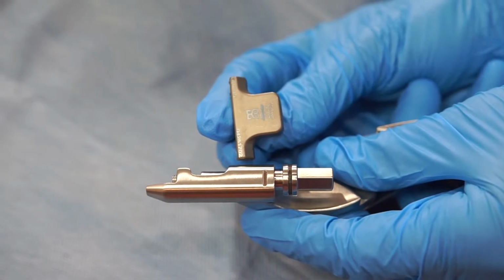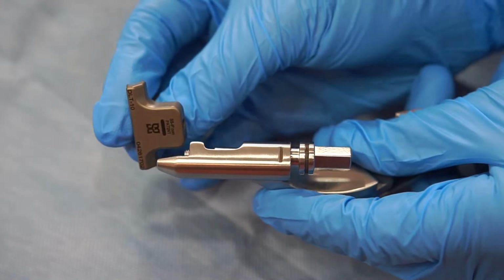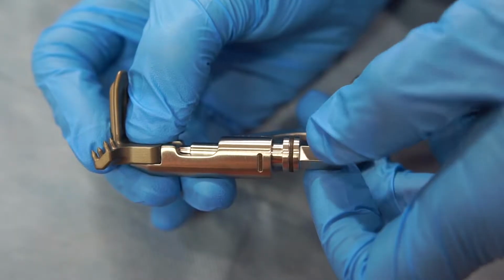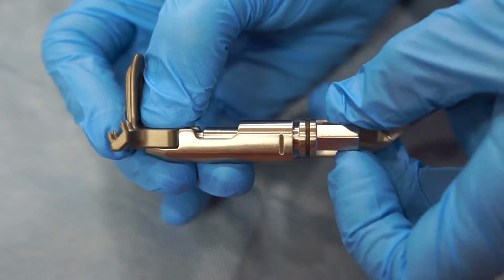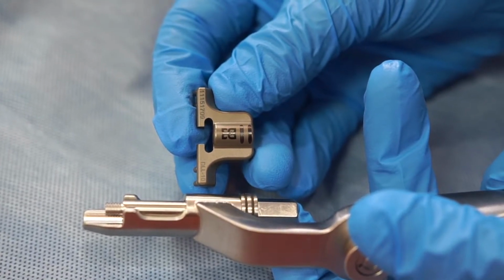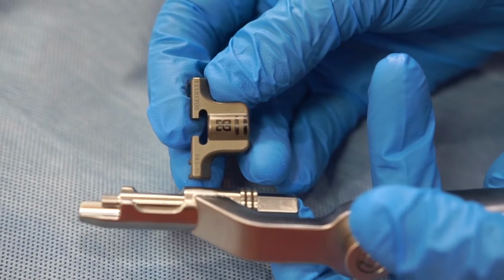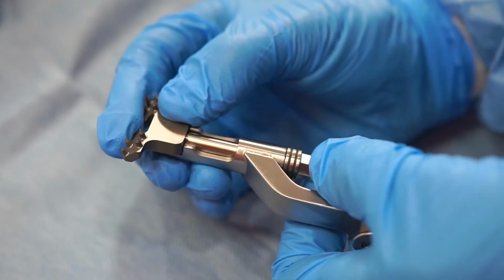Load the tray plate side marked with a single dash onto the correspondingly marked hex screw of the PG inserter compressor. Finger tighten the hex screw into the tray plate. Load the lock plate side marked with two dashes onto the correspondingly marked hex screw of the PG inserter compressor. Finger tighten the hex screw into the lock plate.